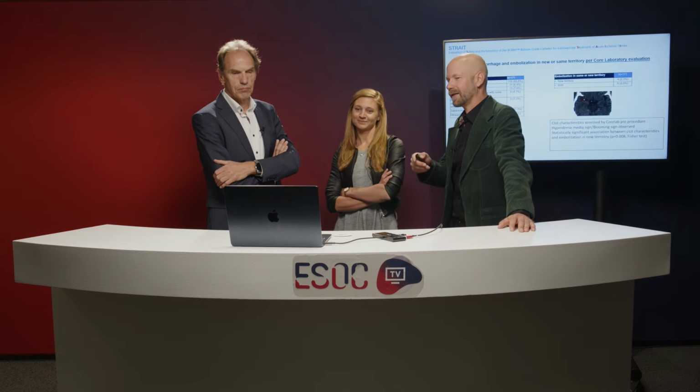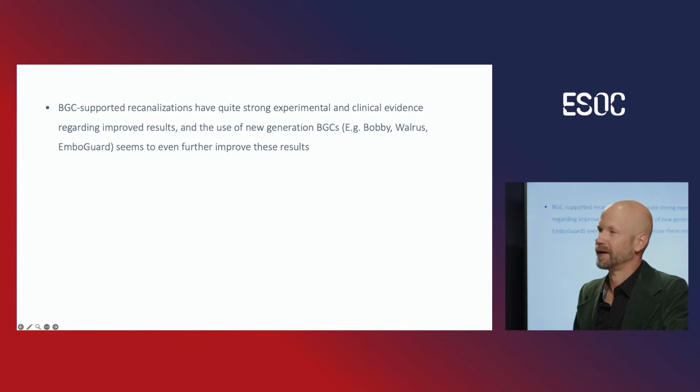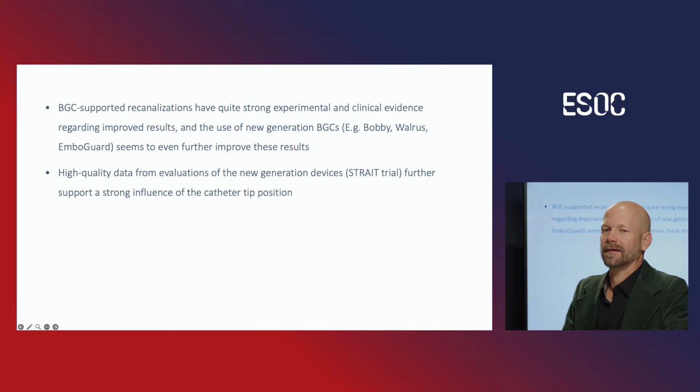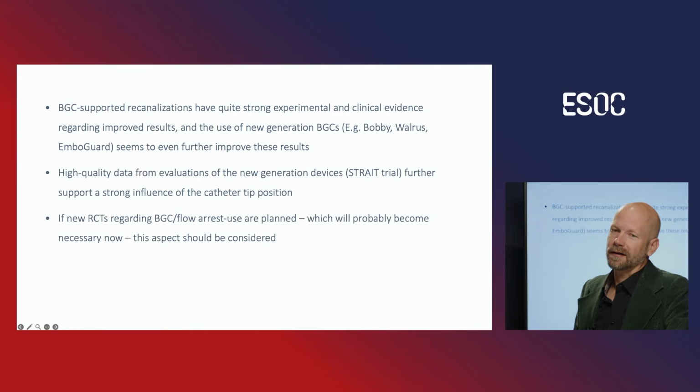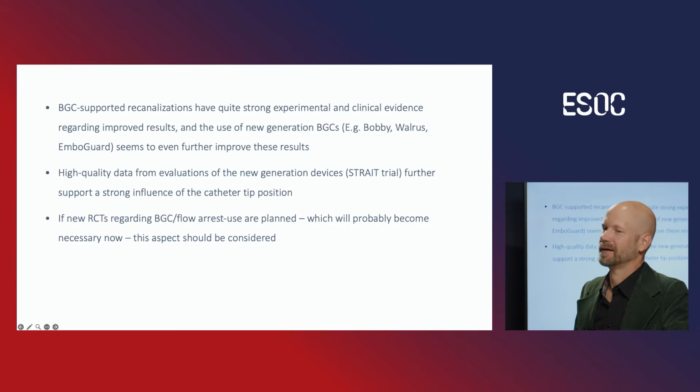I think in conclusion, or in a preliminary conclusion, we could say that the data that we have now further support that, having the newer generation devices, the results improved further. And that the tip position really plays an important role. So if somebody is thinking about doing another trial, which I think will become necessary, all these aspects should be considered beforehand in the planning phase.